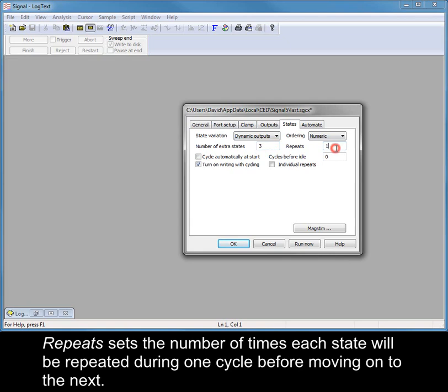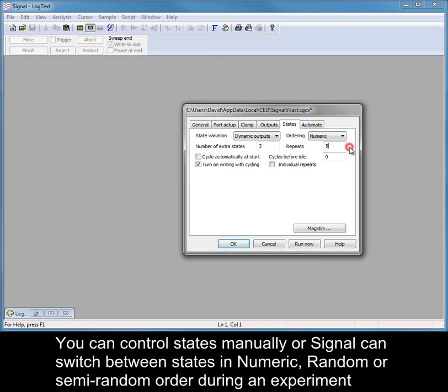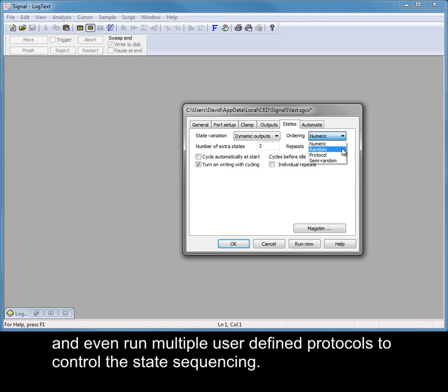Repeats sets the number of times each state will be repeated during one cycle before moving on to the next. You can control states manually, or Signal can switch between states in numeric, random, or semi-random order during an experiment, and even run multiple user-defined protocols to control the state sequencing.